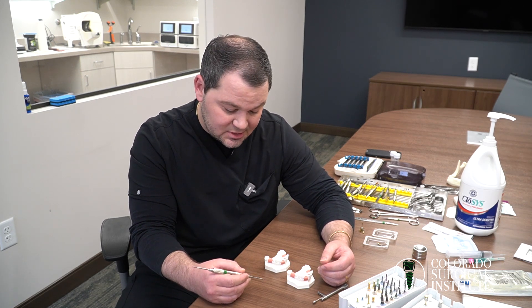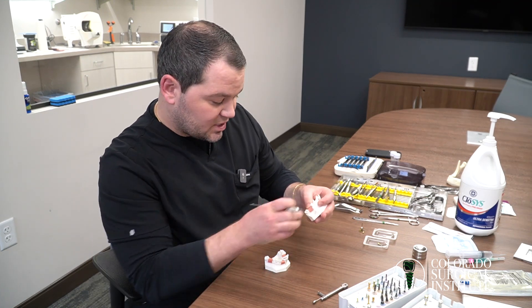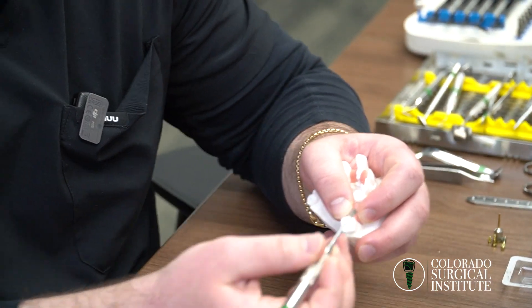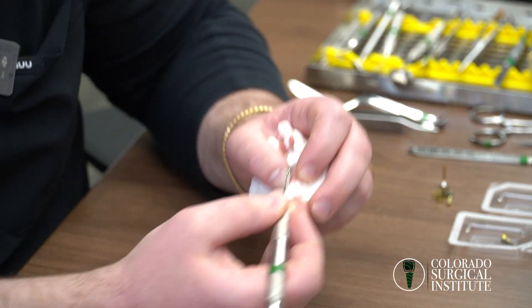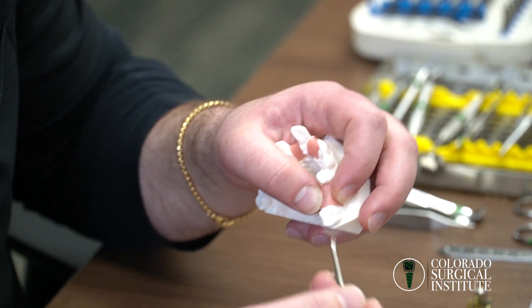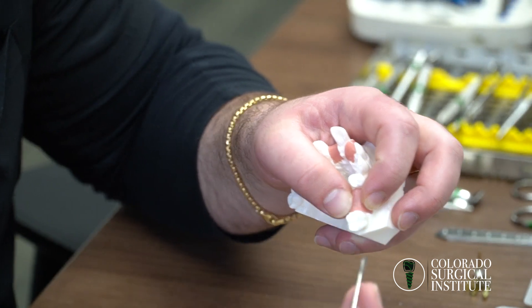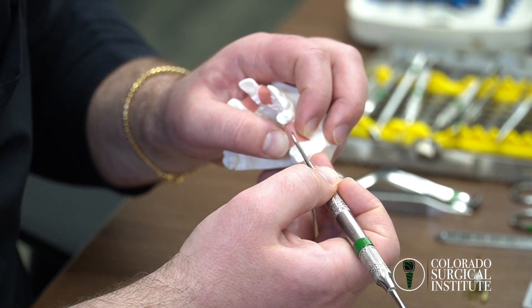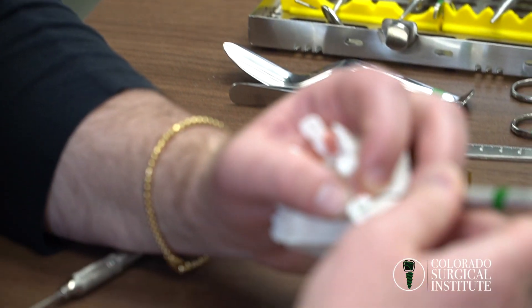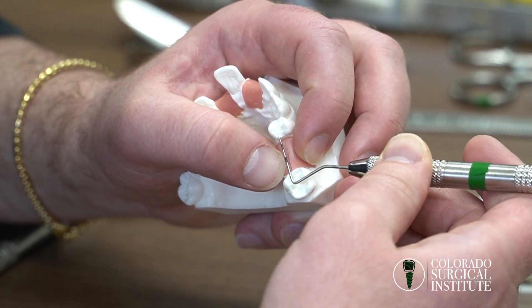One of the most common mistakes we see during our classes is where to put the incision line. When making an incision for placing one implant, you want to see where mid-crestal is — the center of the ridge. You want to make your incision slightly lingualized, about one to two millimeters more lingual than mid-crestal.